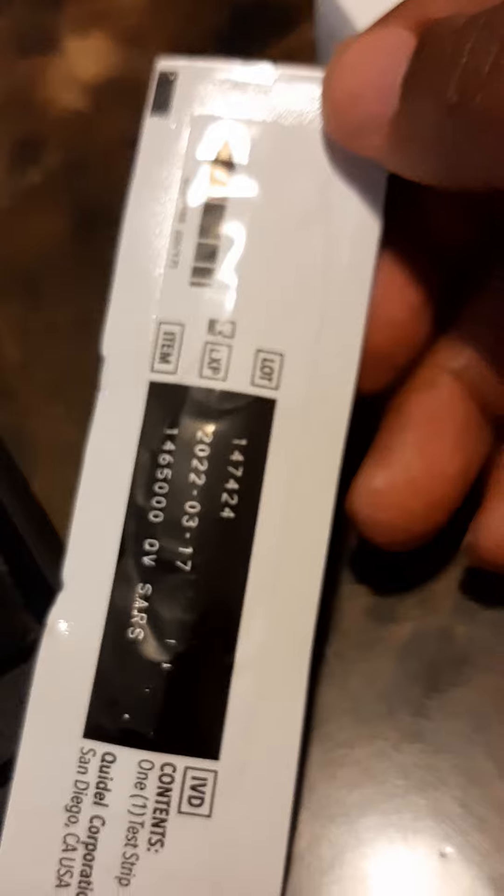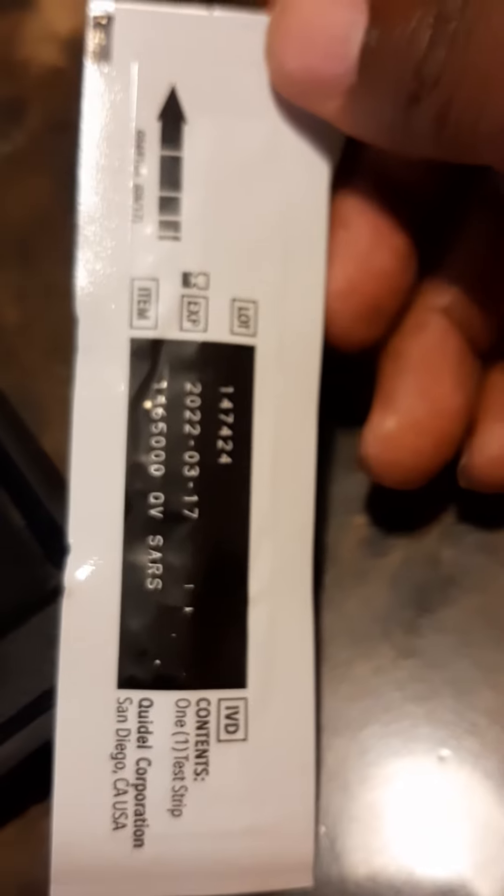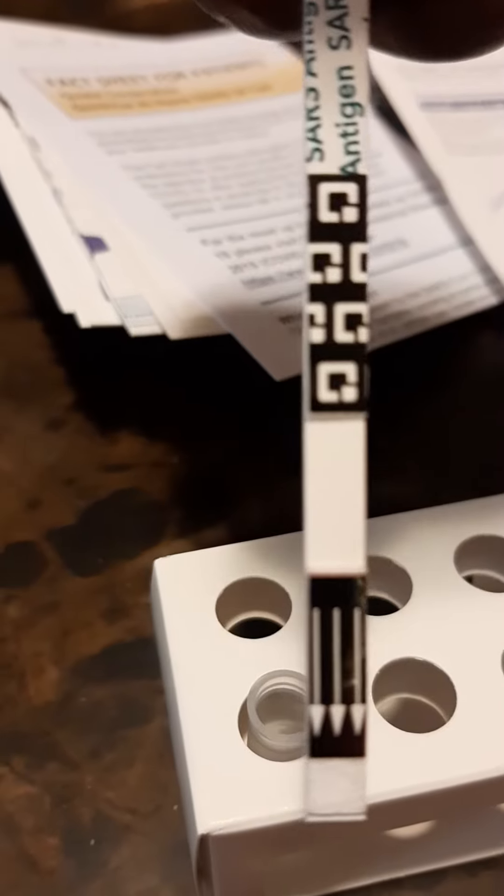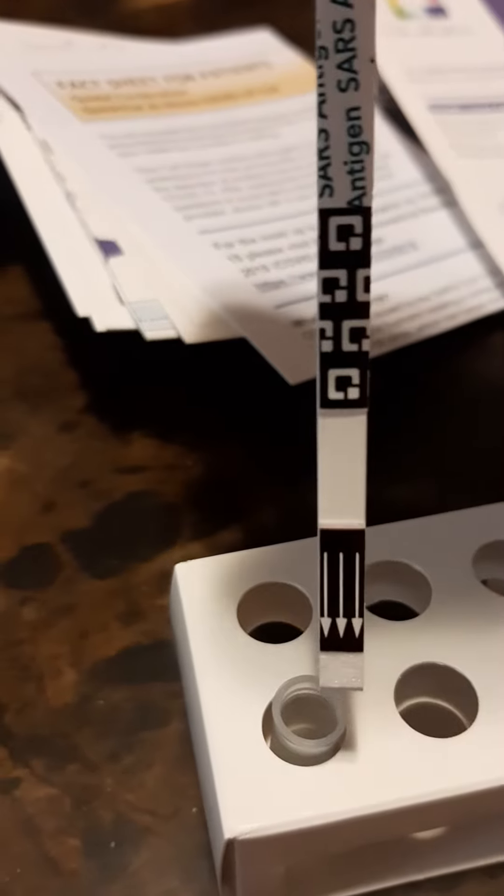Throw that away. Test strip. Open this. All right, got a test strip. Put this in there.